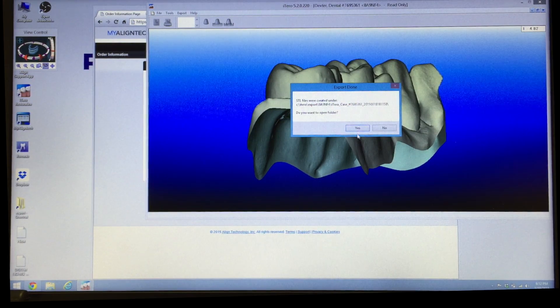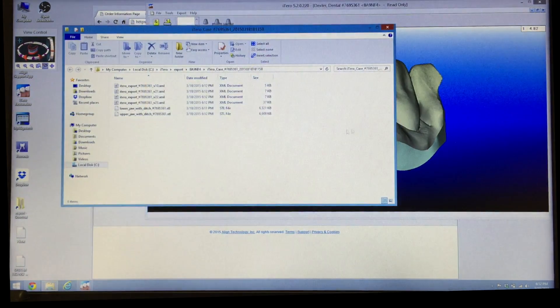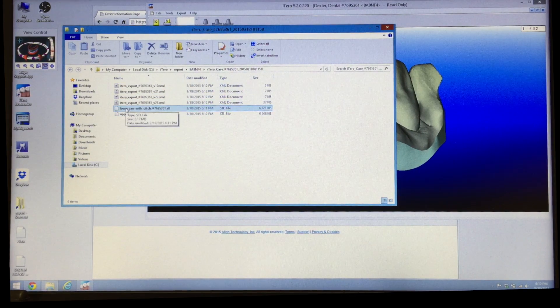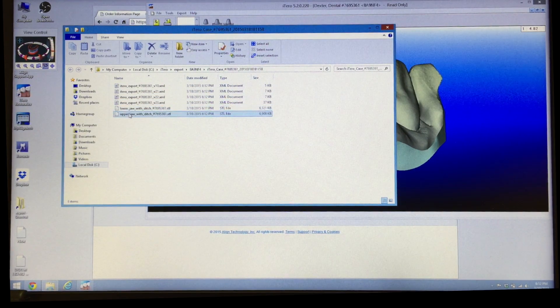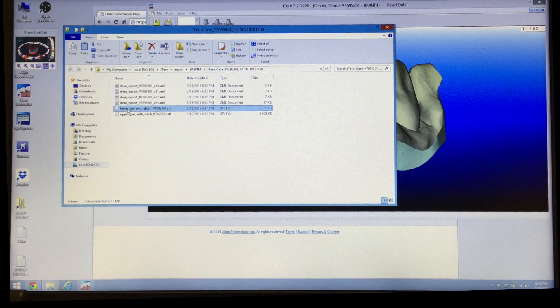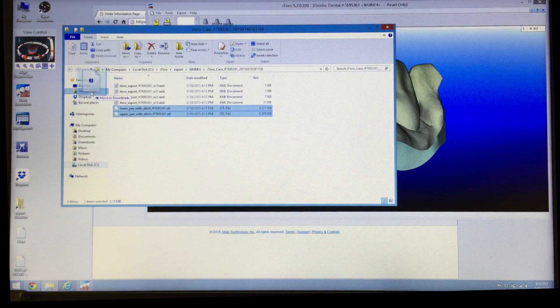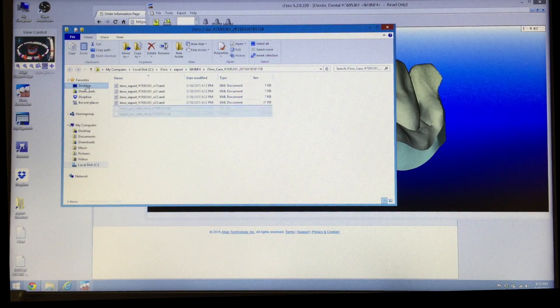It asks do you want to open the folder? We say yes and over here you're going to see a list of different files in that folder. The only two we're interested in are the ones labeled lower jaw and upper jaw. Click that, hold the shift key and highlight the other one as well, and now we're going to move those two files over to the desktop.